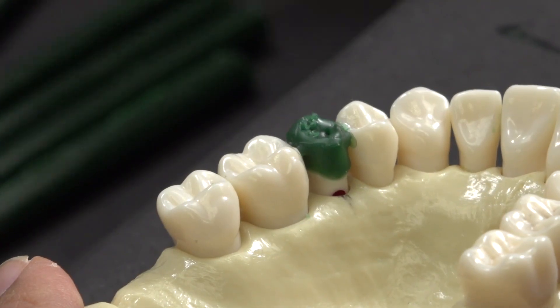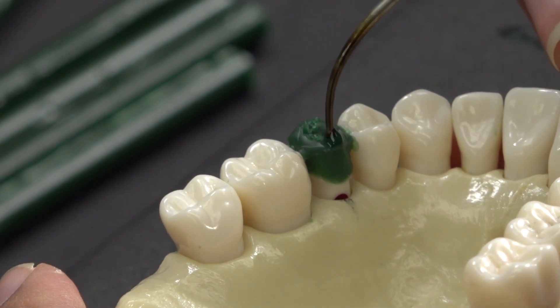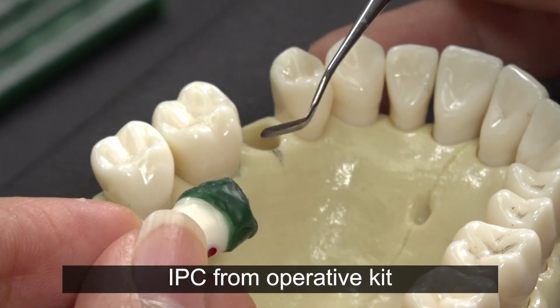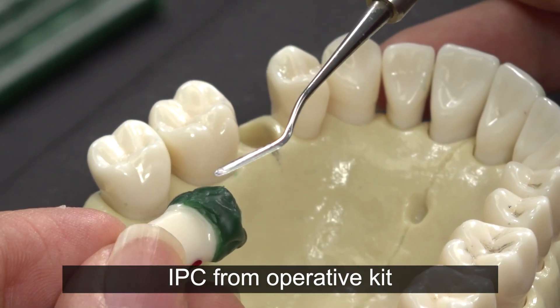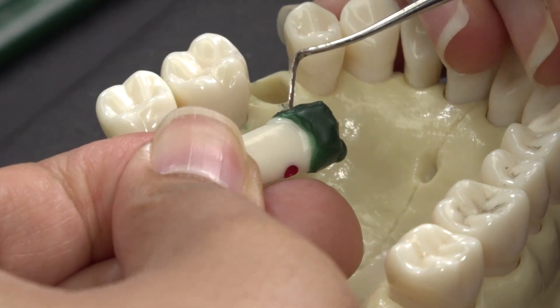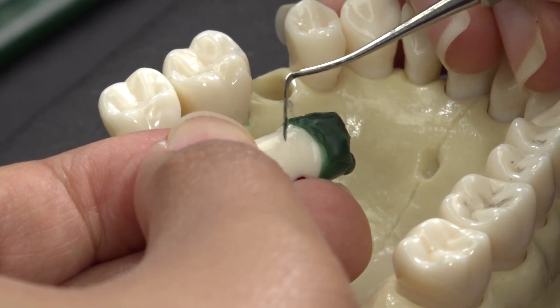Be mindful of where the cusp tip should be placed when building the tooth. You can do this by following the line that you drew earlier. Clean up the bulky interproximal margins with the carver. I like to use the IPC from the operative kit, using light strokes with the IPC slanted at about a 45 degree angle to create the slanted interproximal slope.